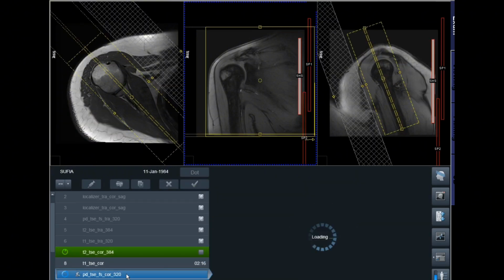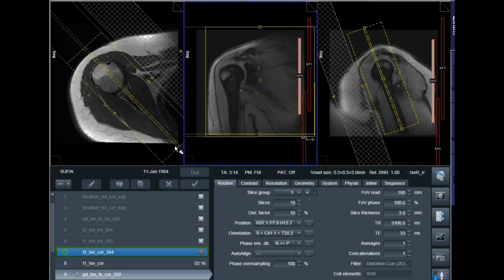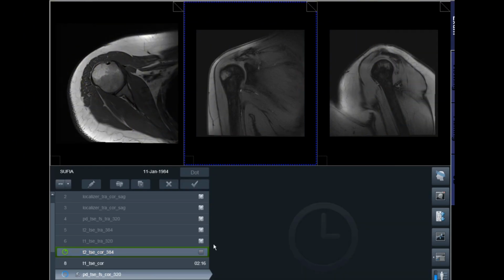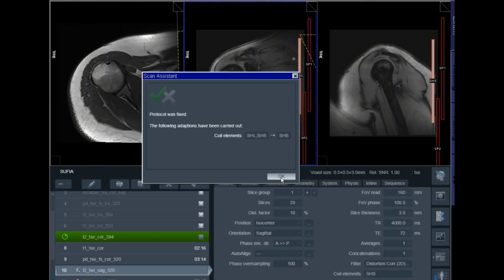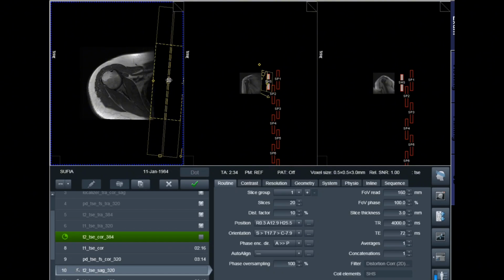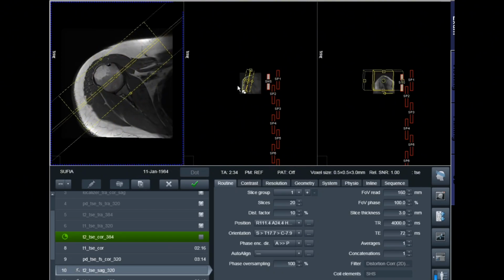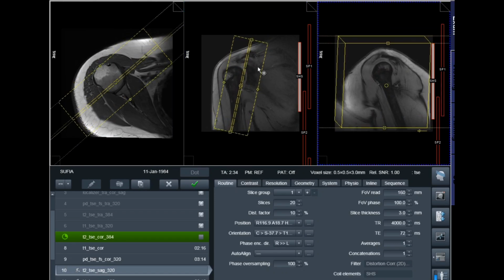Impingement syndrome. MRI findings: reduced subacromial space, acromial spur, supraspinatus tendon compression, associated bursitis, often associated with type 2 or 3 acromion morphology. Labral pathology. MRI can detect SLAP lesions, Bankart lesions, posterior labral tears. MRI arthrography provides superior sensitivity for subtle labral tears.